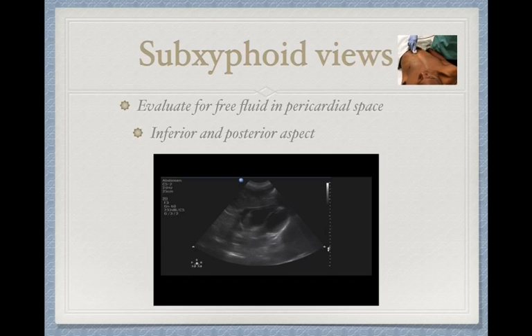All right, so again, here we are with our small pericardial effusion. You can see that just anterior there. In the setting of trauma, this is going to be important. It's going to be subtle, but you know that, especially in an unstable patient, that's going to help your surgeon know which cavity to open first.